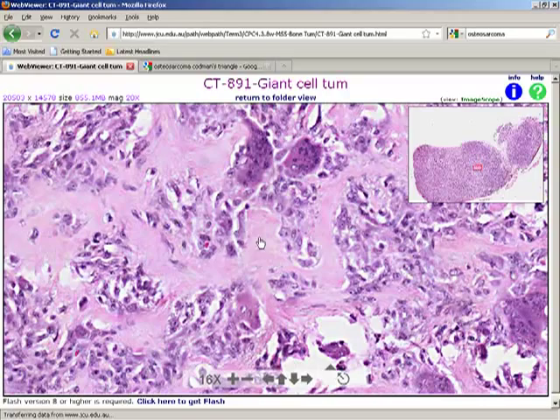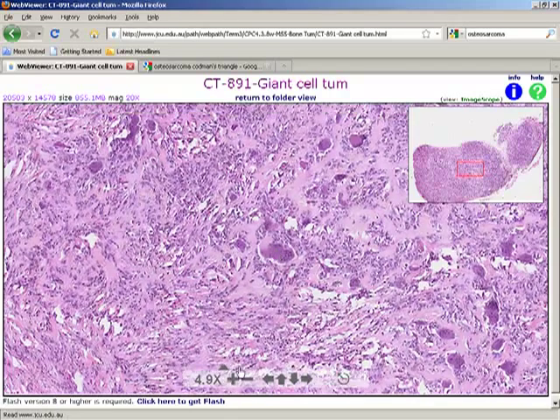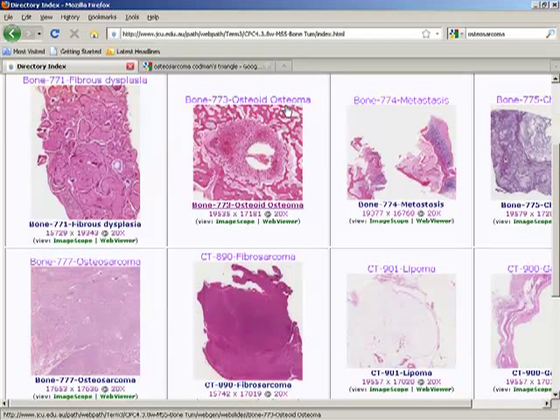And notice that even this tumor also produces osteoid, and plenty of these big multinucleated giant cells, multiple nuclei. That's all. Giant cell tumor. That is an osteoid osteoma, osteosarcoma, lipoma. Lipoma, fat tissue, congenital disorders, multiple endocrine neoplasia associated with.